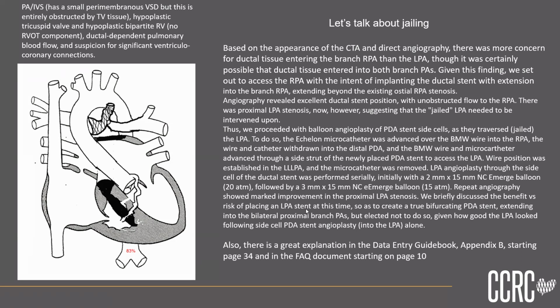Just looking at this, they didn't use a bifurcating stent, right? No, they did not use it, but they thought about putting a stent through that side cell. But I've done cath a while, and the enemy of good is better. Sometimes if you try to fix it to be perfect, when it's good enough and had good flow, it's better to leave it alone, let the kid grow and figure it out.